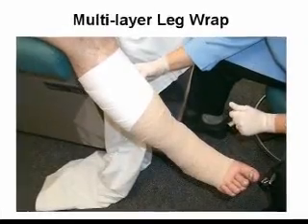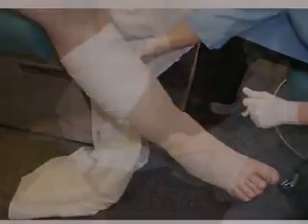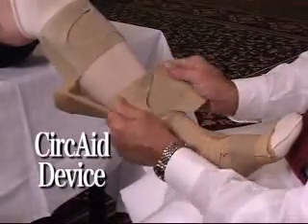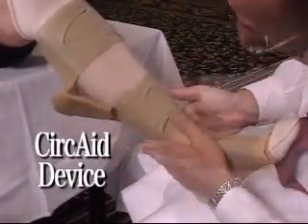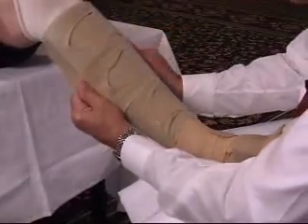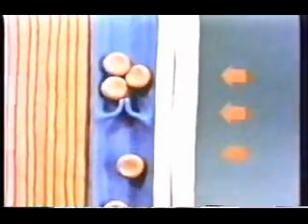The mainstay of therapy for these conditions is compression therapy, which consists of bandages, stockings, or circular devices applied to the leg to limit or prevent the leakage of blood into the surface venous system during calf muscle contraction. The pressure of these external devices must exceed the ambulatory deep venous pressure, so the blood has more of a tendency to go up the leg in the deep venous system toward the heart than leak out to the leg's surface.